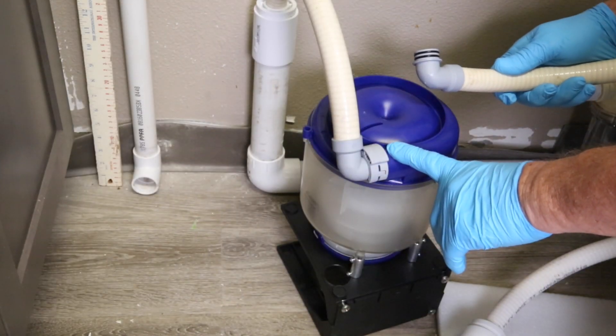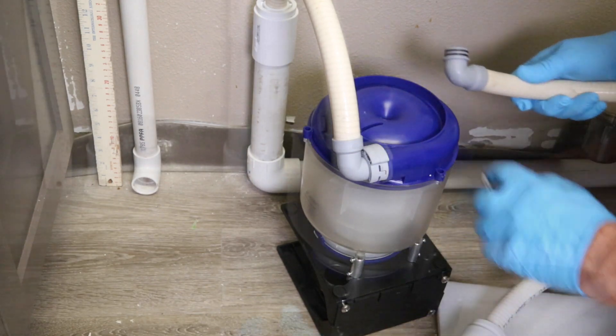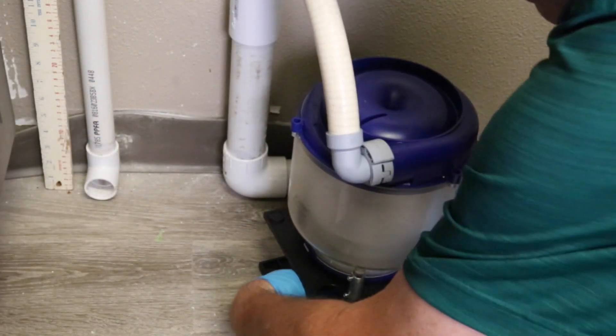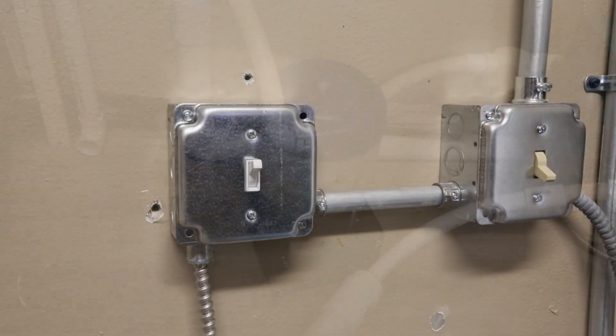Repeat this process for both the inlet and outlet connections. Once the installation is completed, turn the vacuum back on and check for leaks.